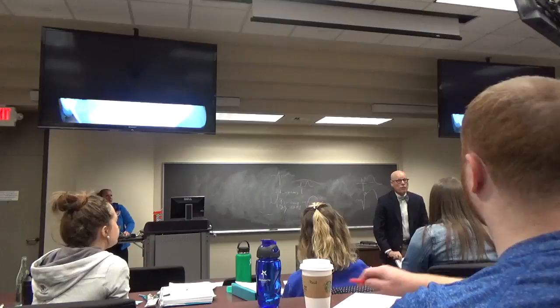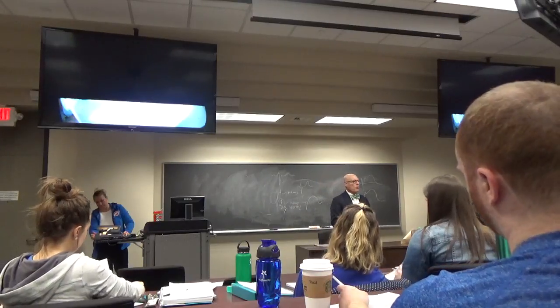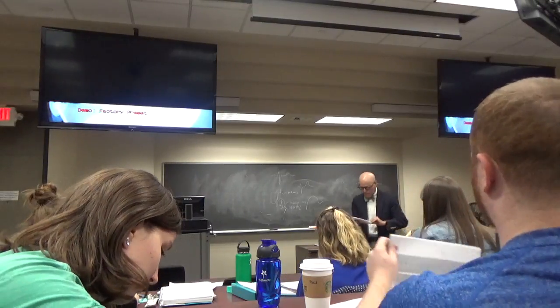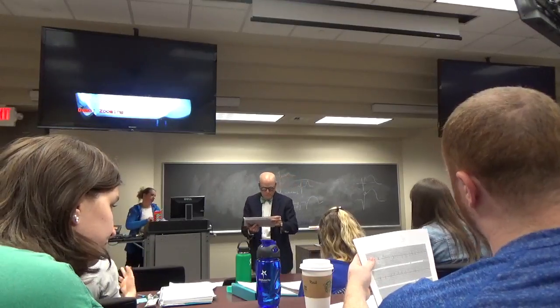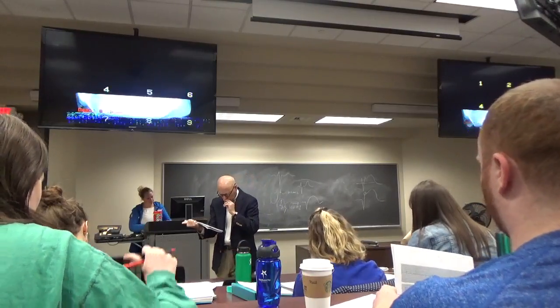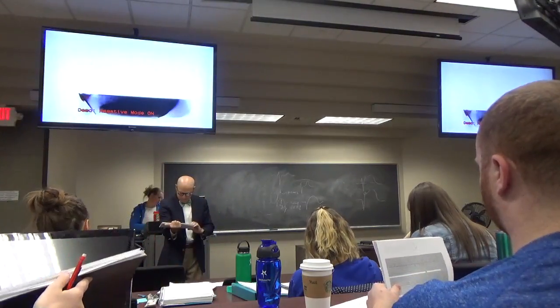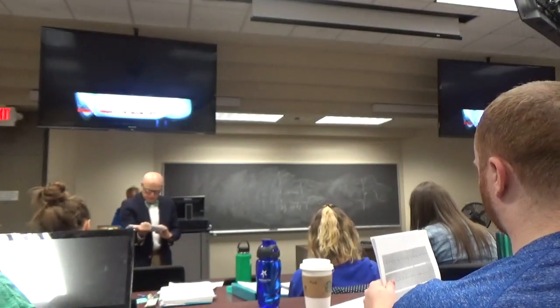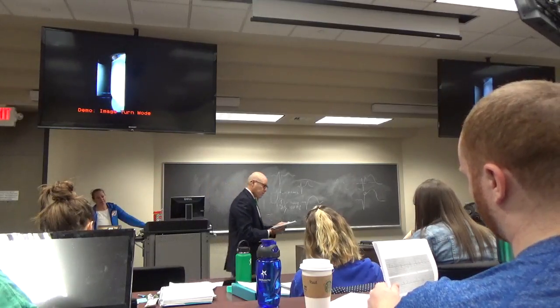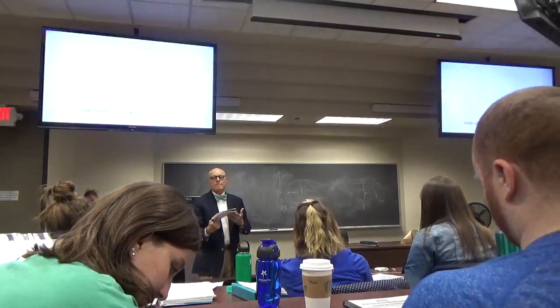Other questions? So for Friday, you'll do through 40, and Professor Rick will go over. So on that last one, was it an injury or was it a... On 30? On 30. Because there is no Q wave. I called it a lateral wall infarct. I called it an old inferior infarct, and lateral extent. Lateral wall infarct, left atrial abnormality, and old inferior infarct, is what I call it. Left atrial what? Abnormality. Okay.